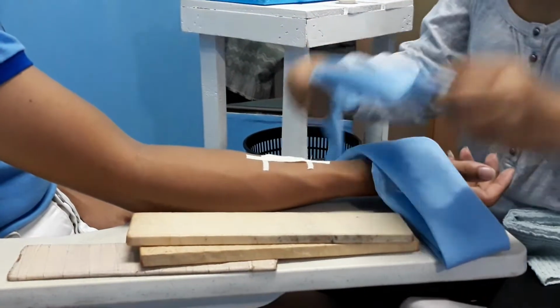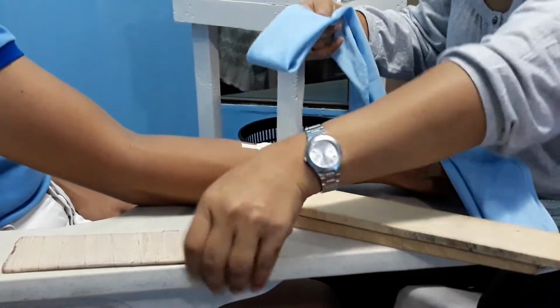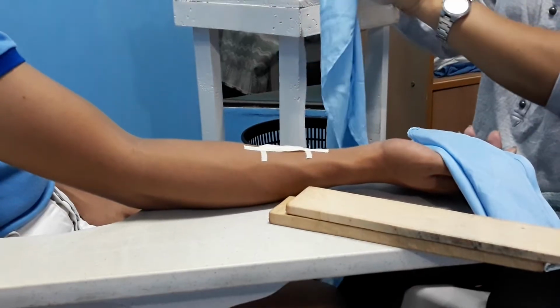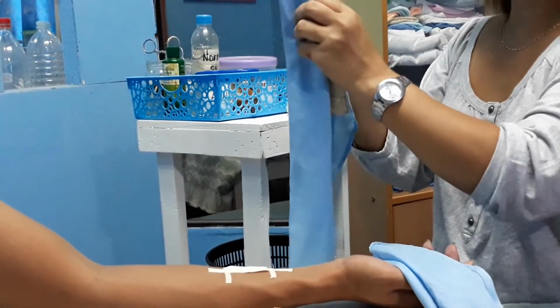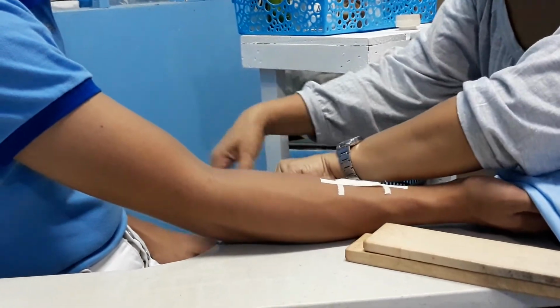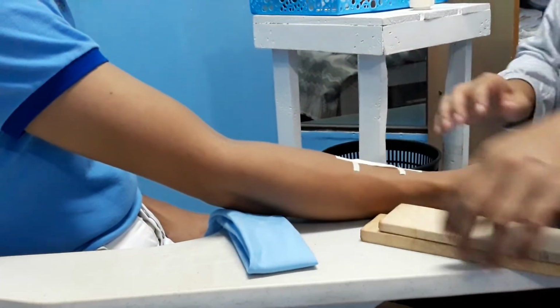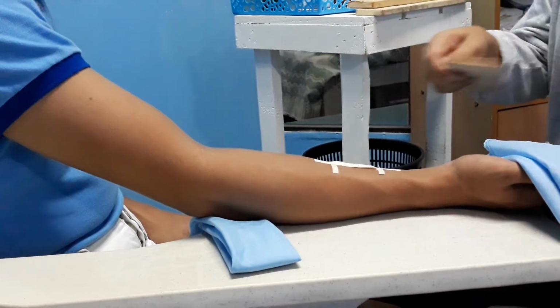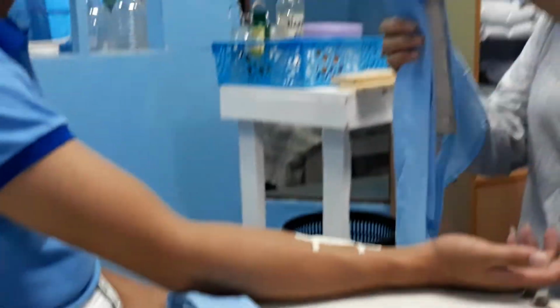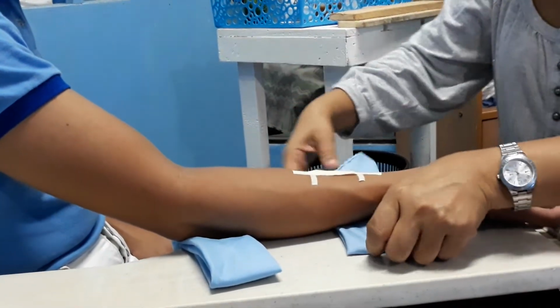Okay, so these are your two bandages. In applying that, of course, if the patient has a fracture, you have to keep the patient's arm from moving. As you can see, the bandage applied is not even in length. Why? In having this procedure or any other procedure, you have to develop your system, for your convenience and for the convenience of your patient. So we use these small splints just to insert the bandage like that.